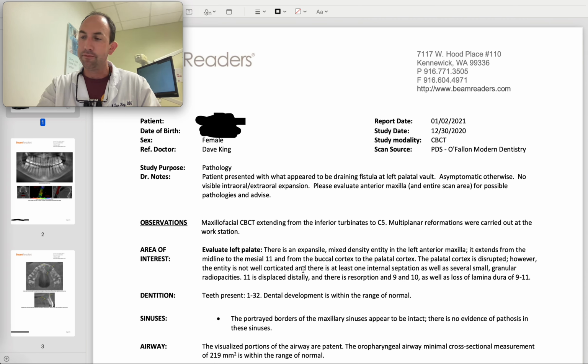What's the charge per scan? When you're new to Beam Readers, you get three free scans, meaning you can upload 3 scans and get this type of report for free 3 times. And it's tracked. If you get an invoice from Beam Readers to the office or to your email, which is what happened to me, just send it on to the appropriate accounts receivable people, and they'll get it taken care of. Normally what I did is I just responded and said, hey, this should be going to our corporate support office partner, and they immediately fixed it. It's just kind of a system-generated email.